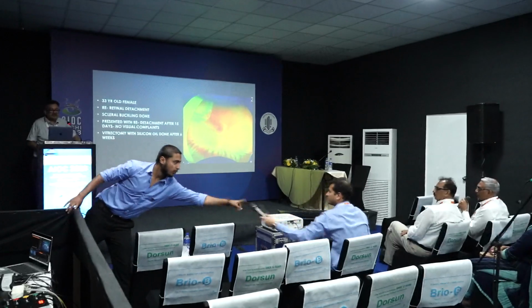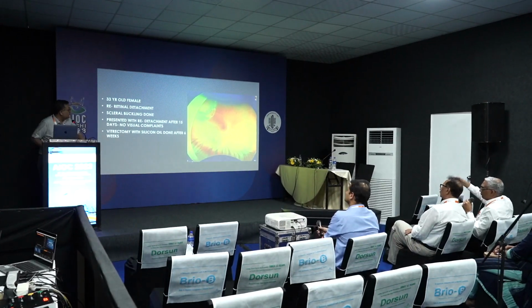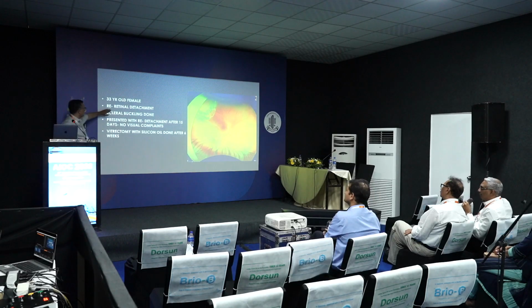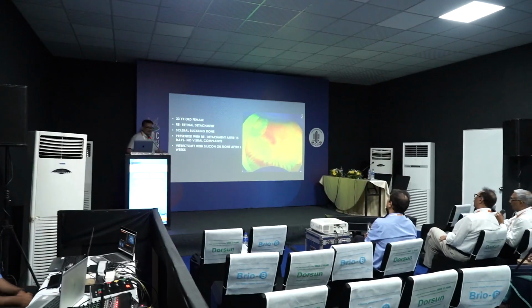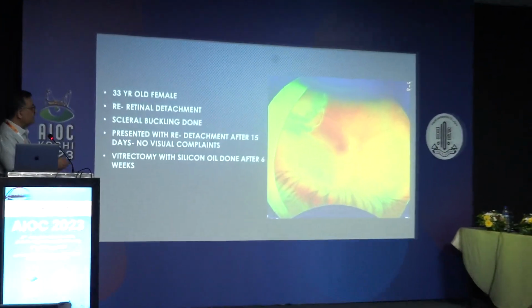We'll have to check the fundus. When you look at that upper lesion, where was the previous buckle? Can we see? No buckle, this is pre-surgery. Pre-surgery, no laser, nothing. This is a photograph pre-buckling. So what would you plan in such a case, if you can't find a definite break?